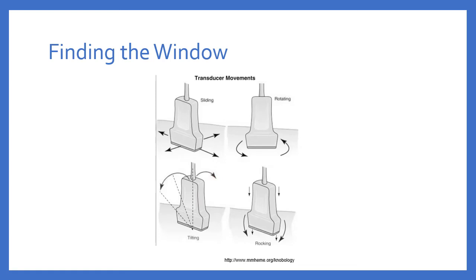Oftentimes these movements are very small movements that can make a big difference in what you're seeing. And so you'll find that these small movements will help you get the image that you are looking for so you can make a right interpretation.